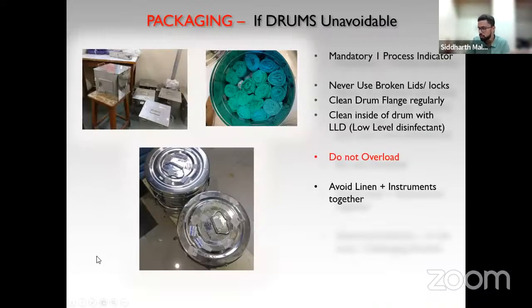Just in case you still decide to use the drums, do not overload them. Avoid putting linen and instruments together. Have a separate drum for linen. Have a separate drum or a tray for instruments. Put the assurance indicator in the most challenging locations below.